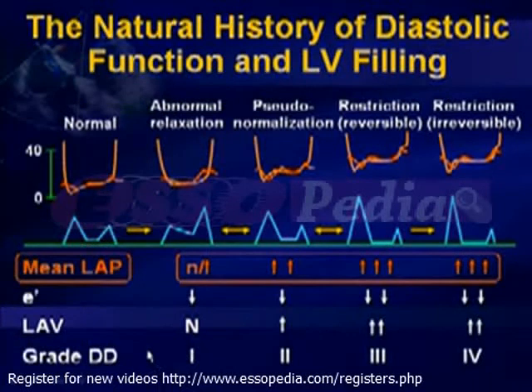See, if we go back and look at the natural history of diastolic function in LV filling, we notice that almost universal to all individuals with abnormal diastolic function, perhaps aside from those with pericardial disease, there is an abnormality in ventricular function, noted if not by EF, by the presence of reduced annular velocities characterized by the reduced E' velocity.